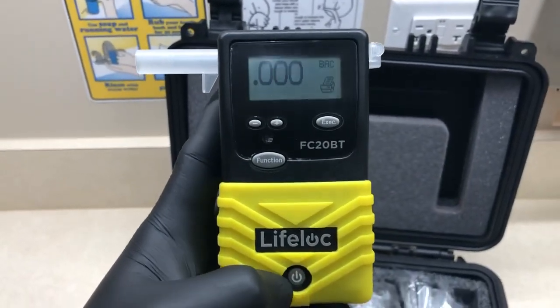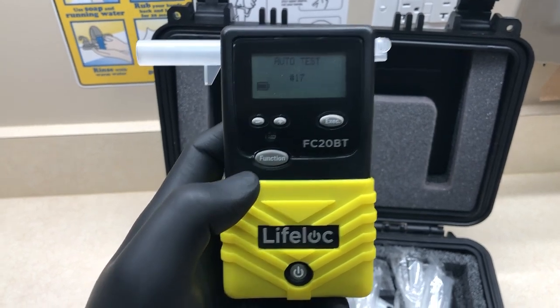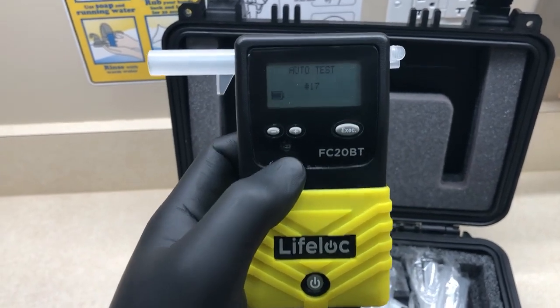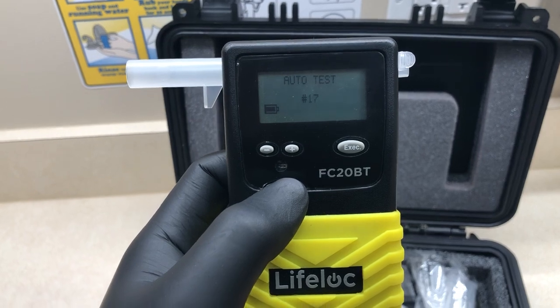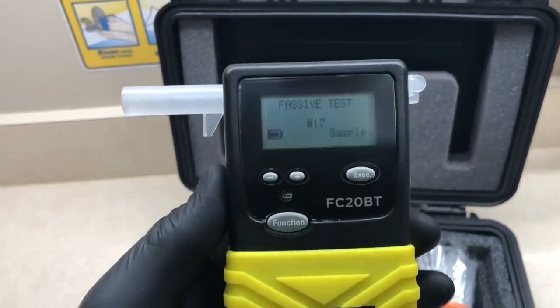And then to go back to the main menu, you're just going to hit the power button once. It doesn't turn it off, it just goes back to the main menu, and it always goes to auto test. The next test we're going to do is the passive test.